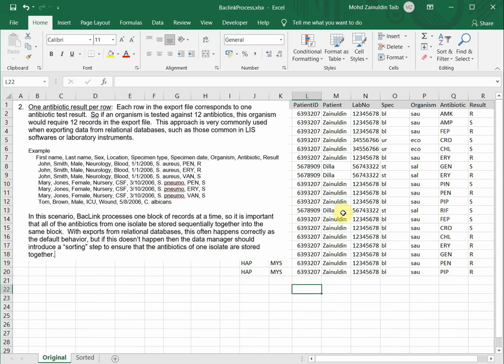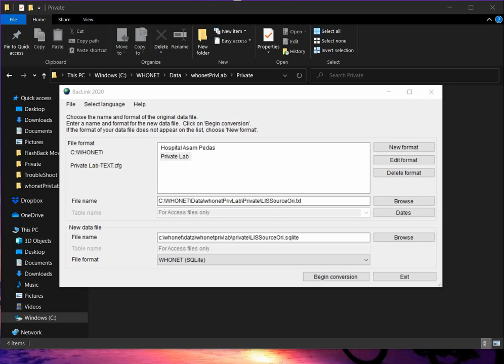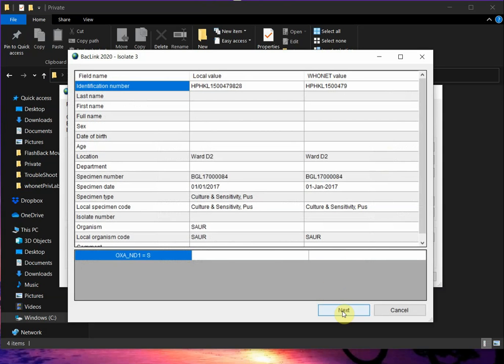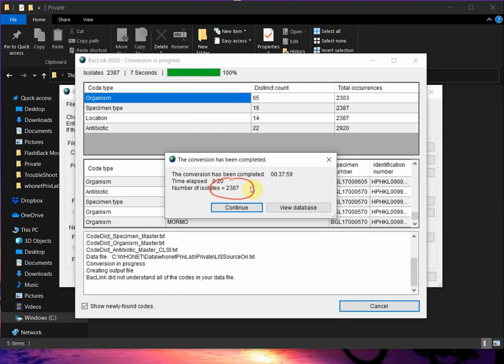If our source data is not in this sorted form, we need to take steps to ensure the antibiotics of one isolate are stored together. Now I'm showing you a real case from one of our participating labs, with more records or more isolates after BacLink conversion from the original LIS data source. I click begin conversion. We just want to see how many isolates it produced. It's processing now. It shows us 2,387 records. But in this lab, usually it's only around 1,000 to 1,500 isolates per month. So it's quite a high number.